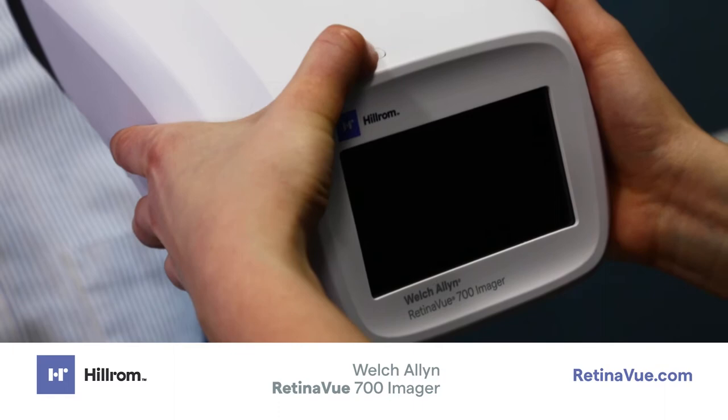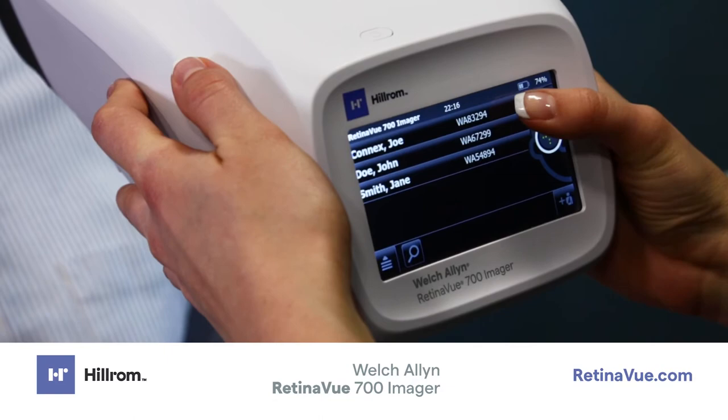Preparing the Imager to Acquire an Image. Turn the Imager on. After boot up, you will be presented with the Patient List screen. Select your patient and confirm the patient information. Touch Exam.